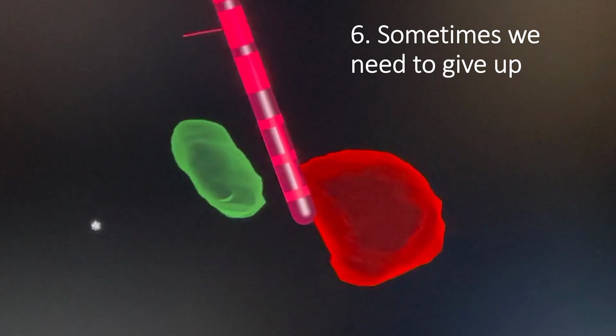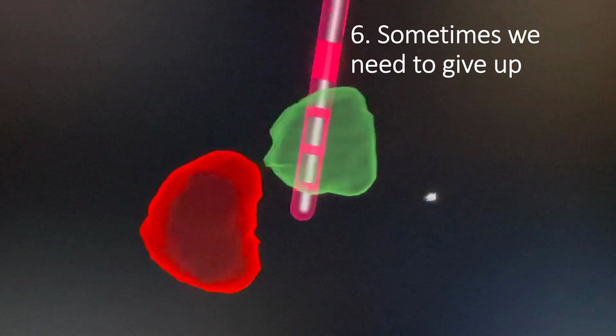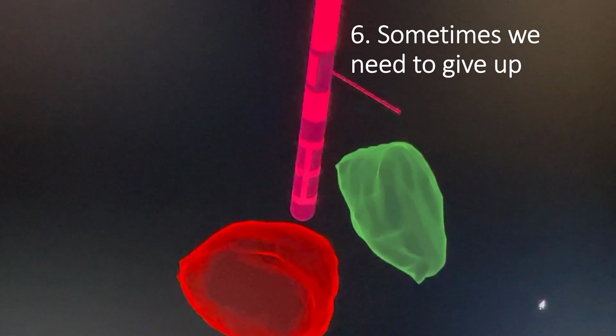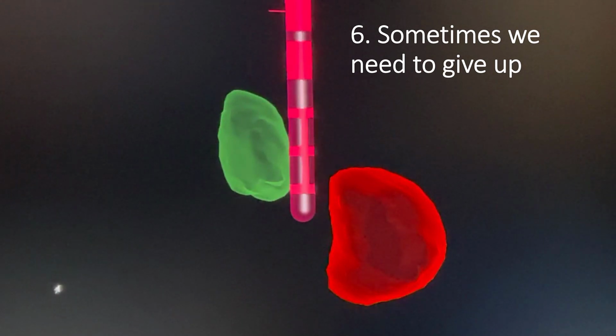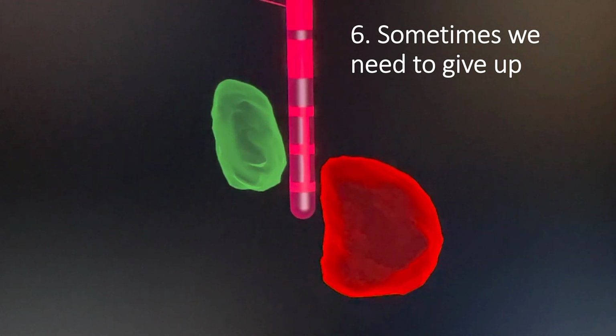If you find that the electrode is completely outside of the intended target, then it is probably better to contact the surgeon instead of wasting your time on programming. Here we see a patient with intended STN-DBS where the electrode is far behind and medial to the STN, and there is no chance for you to reach the intended target with your field of stimulation.